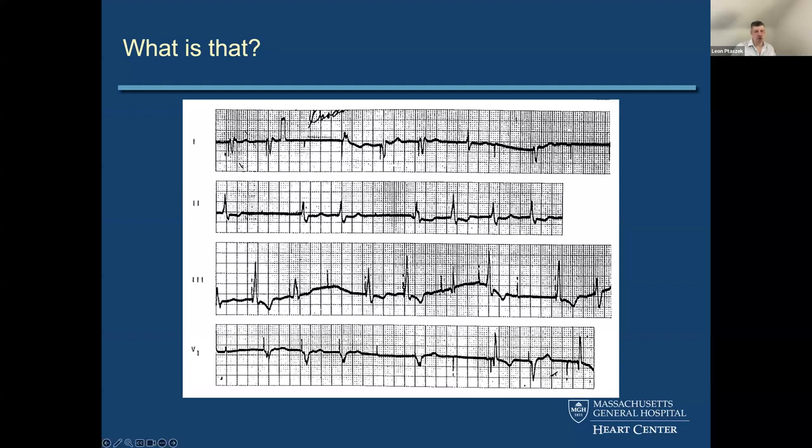This speaks to the age of the tracings that I'm giving you. I'm using the old ones just because they're the best ones that I could find to demonstrate these principles. So here's evidence of ventricular pacing, right? Pacing spike, large QRS complex. Maybe there's a P wave in there, but it's not clearly synchronous. And then you've got a little bit of noise here, who knows what that is, that square wave there. It could be somebody flicking the wire with their finger. But there's no EMI like we saw in the last tracing. The baseline is pretty clean, and it's a thicker baseline just because in that era, that's how they looked. It's a wider pen that would go across the paper.